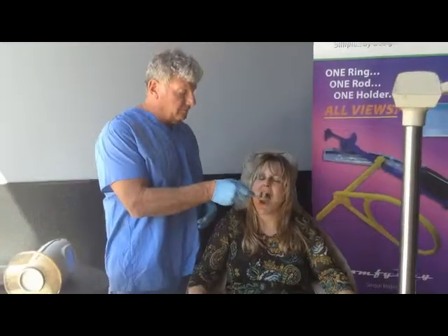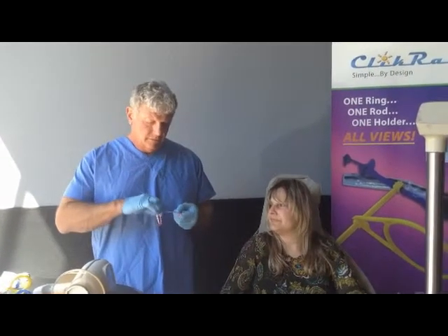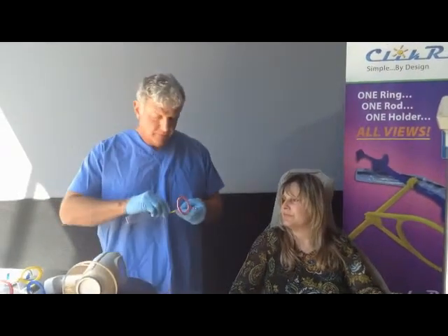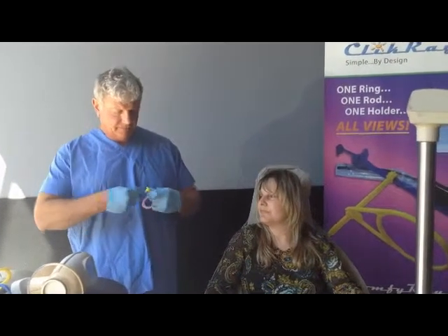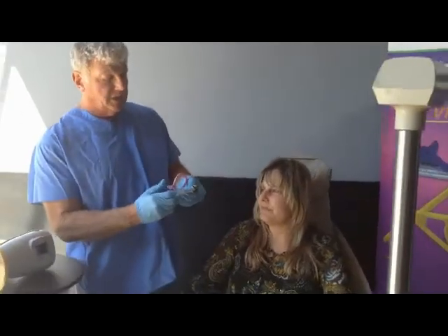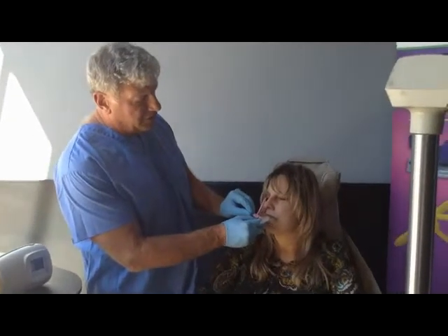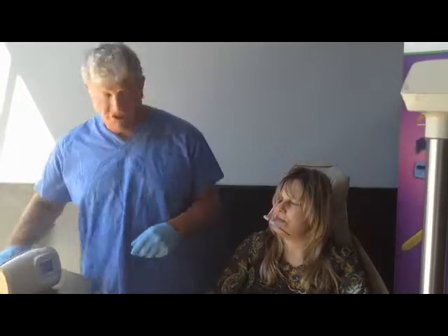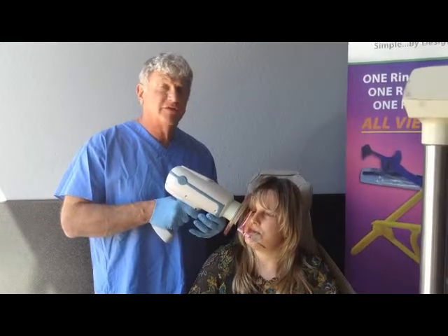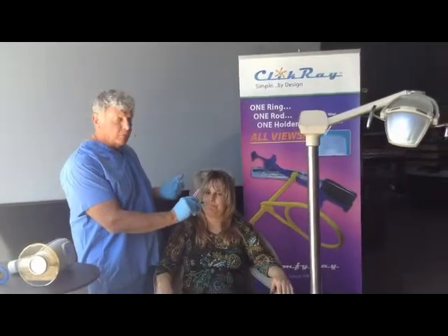Now, with our system, the click stick system, when we place the rod in this position, I'll reposition this to show you exactly. In this case, we're going to get this upper right hand shot. I'll have the patient close down on it. Notice I'm going to push this as far in as possible. Notice how close that ring is to the cheek, and how close I can get the scatter shield. This will give you a very crisp, high definition radiograph. We can proceed to take the upper right hand side.